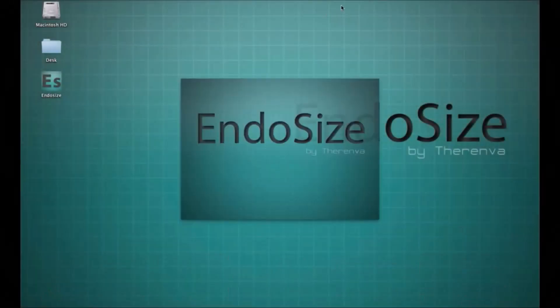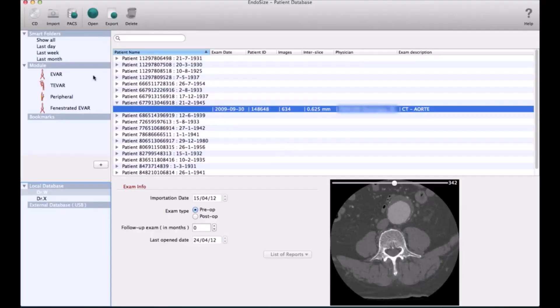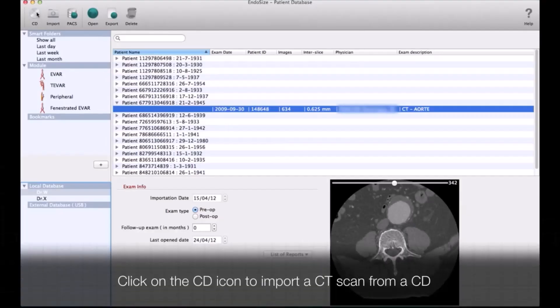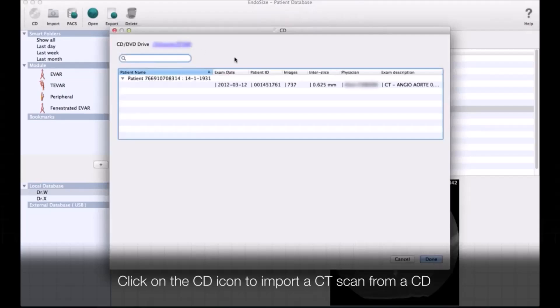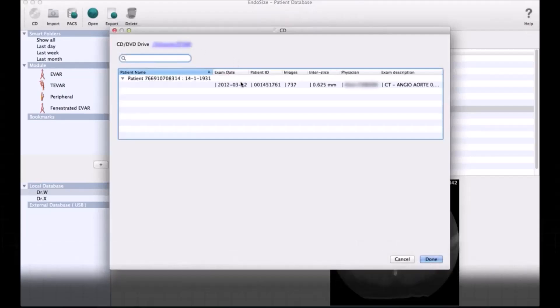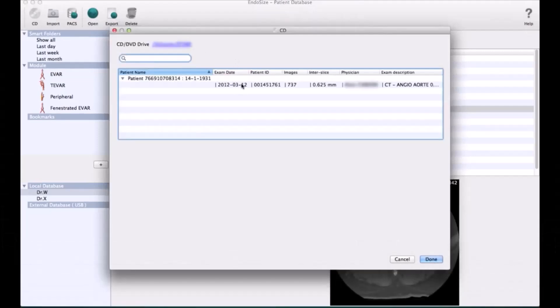It can be used on Windows and also on Mac. You select the patient that you want to import and then you import it to your system.